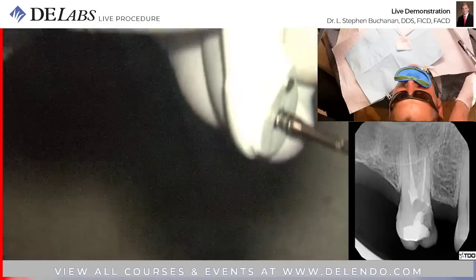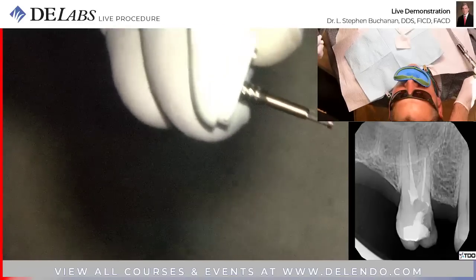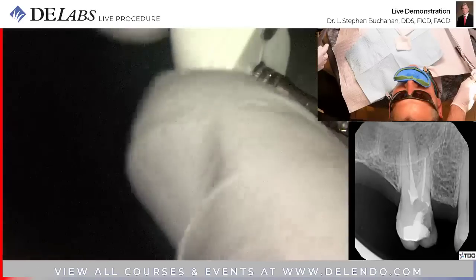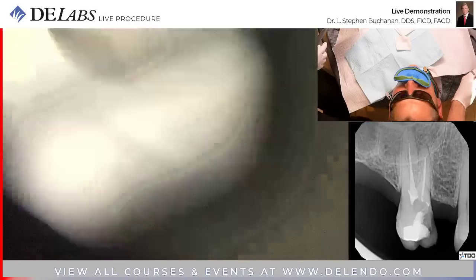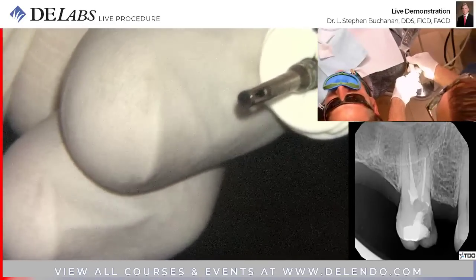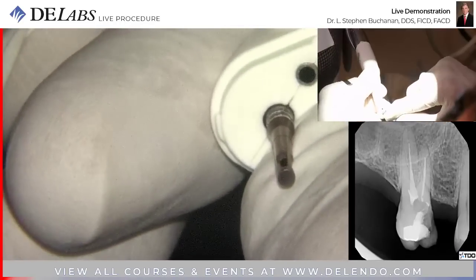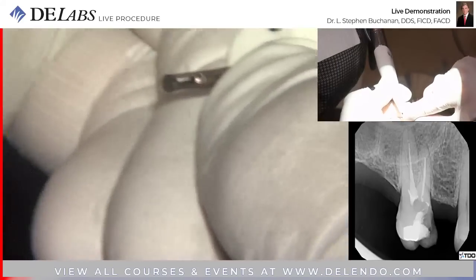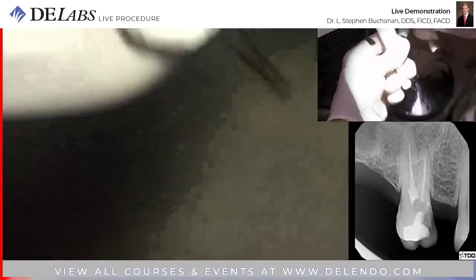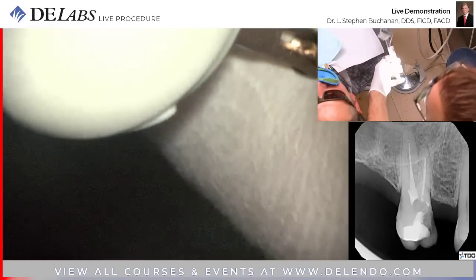So this is one of the coolest inventions I've ever seen, and I have 22 patents. There is a little tube. This is titanium. There's a little passageway inside there. The solution is shot through this handpiece and out this tube at 6,000 psi. It hits this little impingement plate on the inside of the end, and it's rounded.